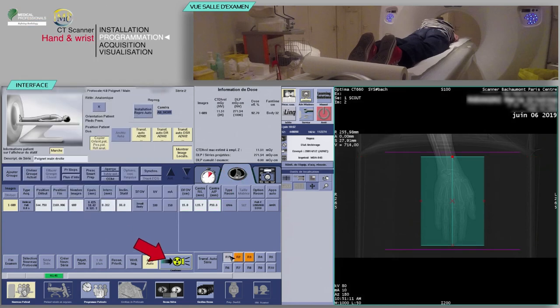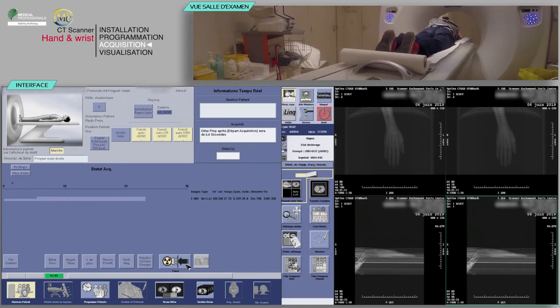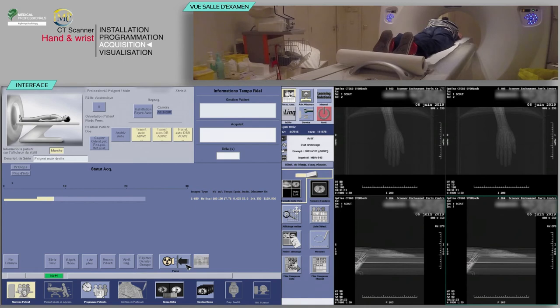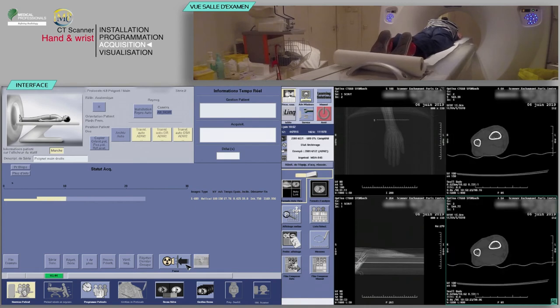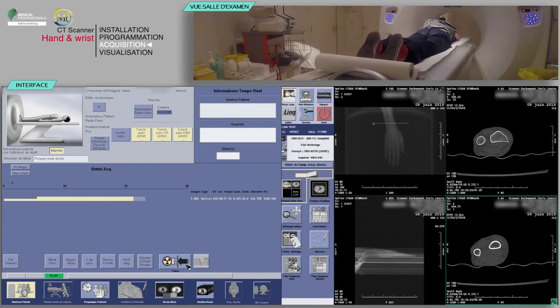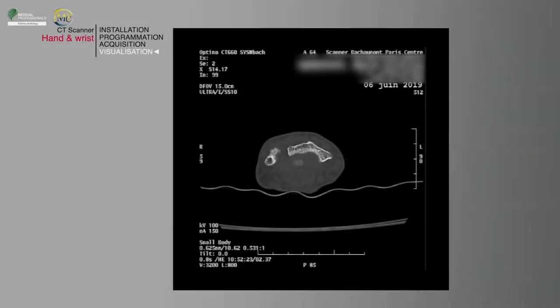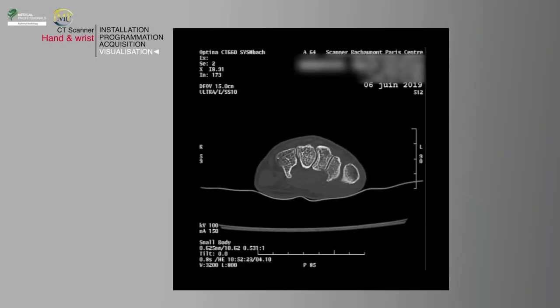Click Confirm. On the keyboard, move the table and scan when the buttons flash. Verify the absence of patient motion on the acquisition.